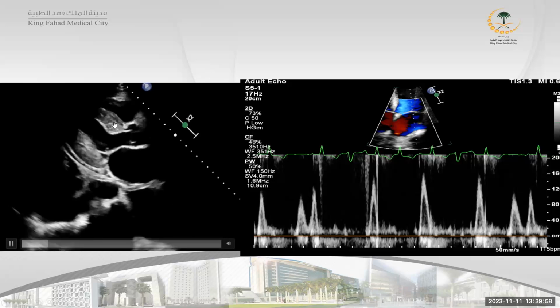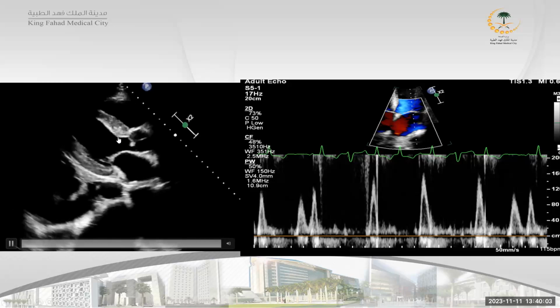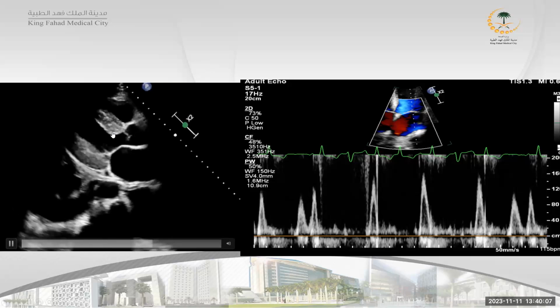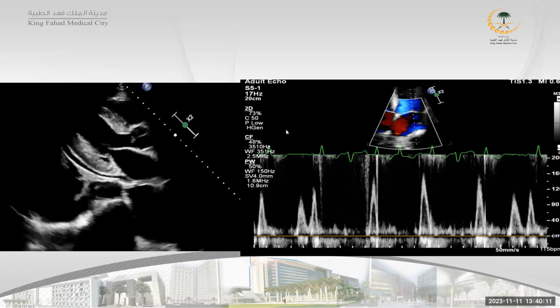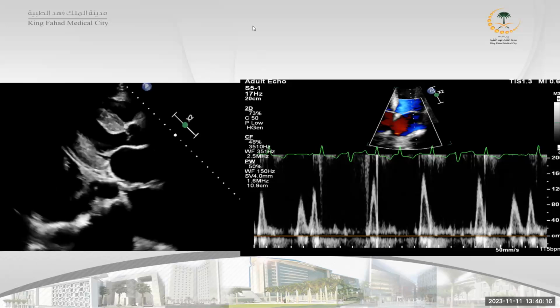You have significant thickening of the walls of the LV, so this is concentric LVH. And as you said, this is hyperechoic, so sparkling of the LV wall. And we have a dilated left atrium. Nice. What else is important to diagnose amyloidosis? PE, not tamponade. Yes, this pericardial effusion is small, not tamponade, that's right.